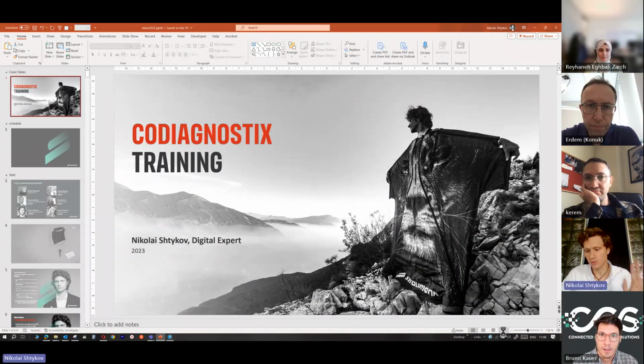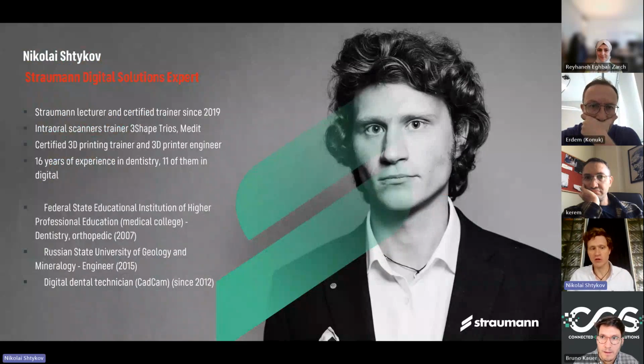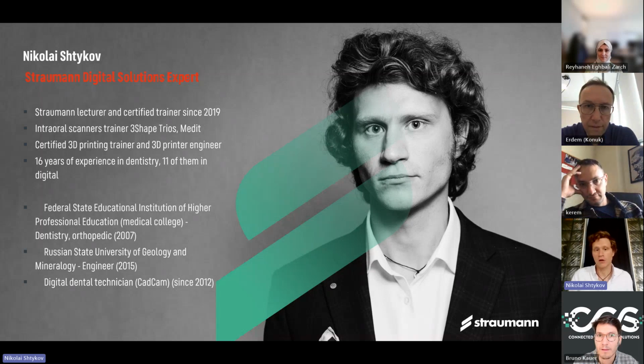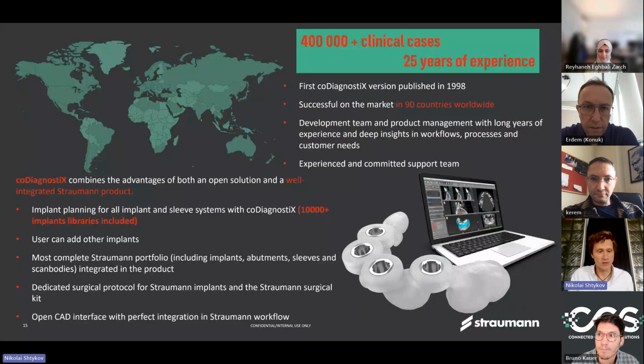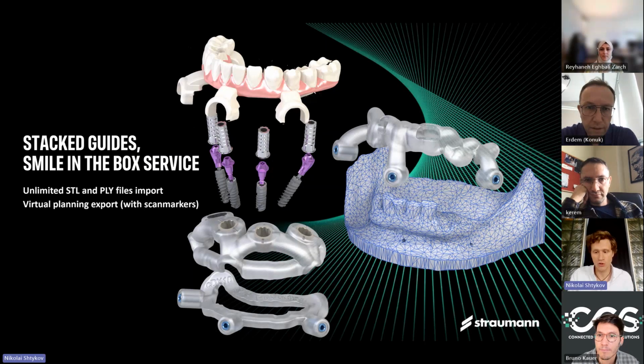I don't show it too much, but I will start by introducing myself. I started as a dental technician, and now I work as a digital expert in Straumann Group and support a lot of digital workflows in Straumann. Okay, CoDiagnostiX. I'll skip some files because you already know about CoDiagnostiX.